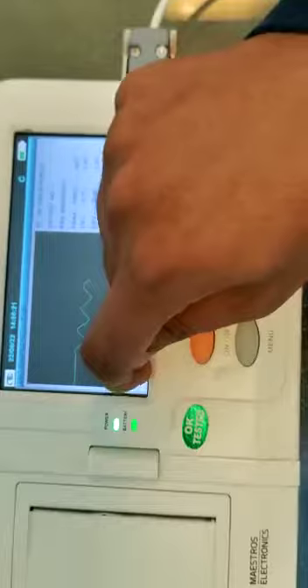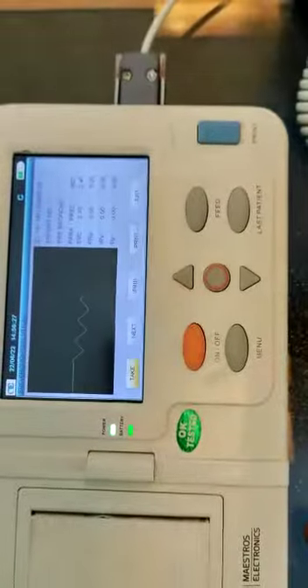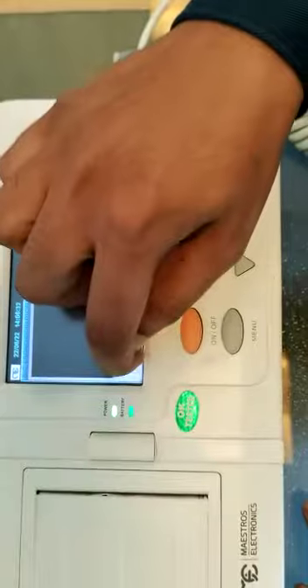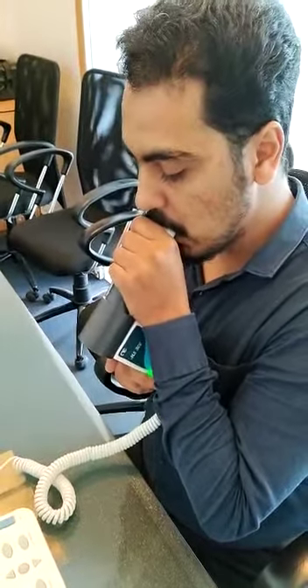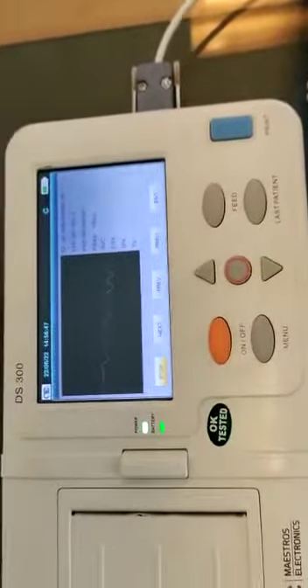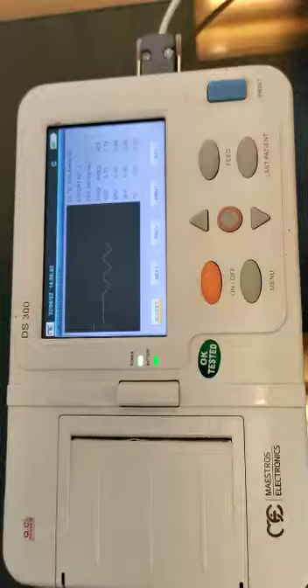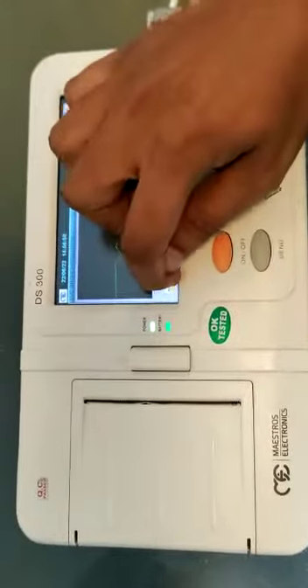If you want to perform it again, you can again click on take, start, and then stop. This test will also be performed for 8 to 10 seconds. Then accept the values.